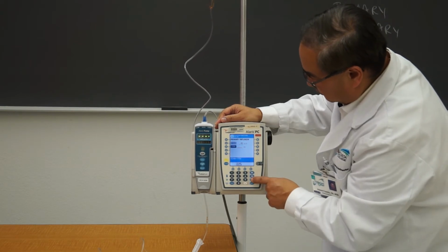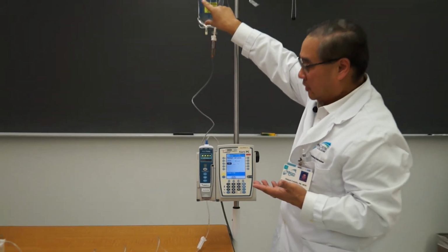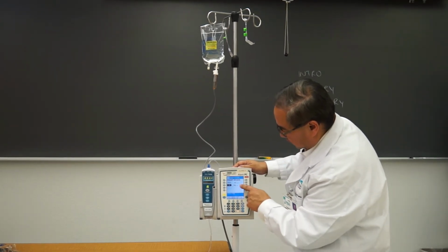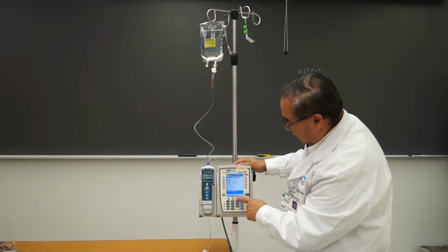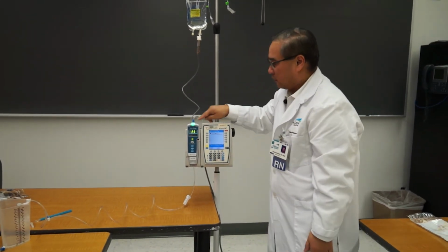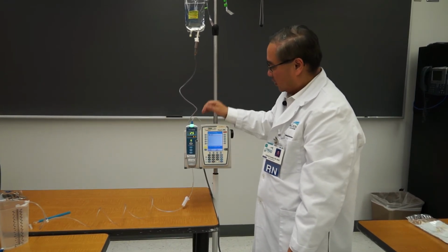Hit enter. Volume to be infused. This is a brand new bag. I know it has 500 milliliters in it, so I can now input, when I press the button it highlights, 500 milliliters. Okay, I can hit enter on that, and then it'll say press start. Ensure that all your clamps are open, and then you press start. You wait for the light to turn green, and the label will scroll here that verifies what you have hung.